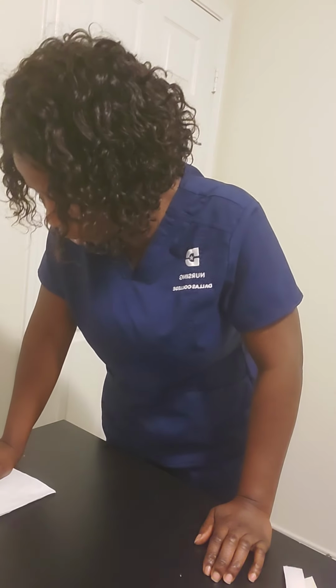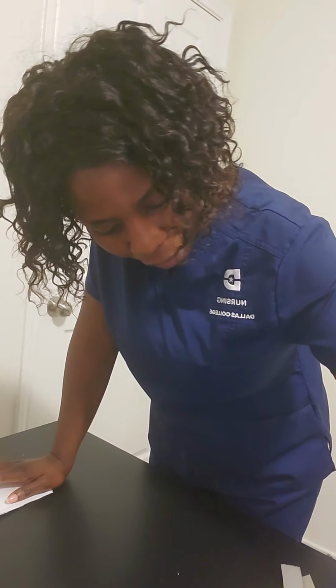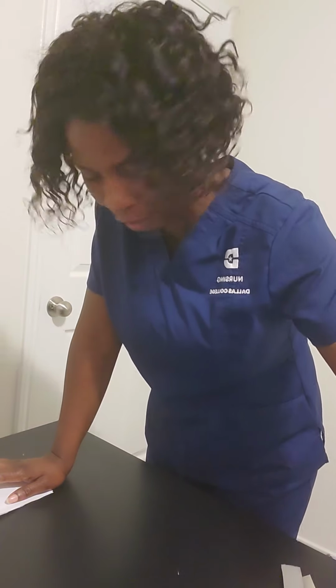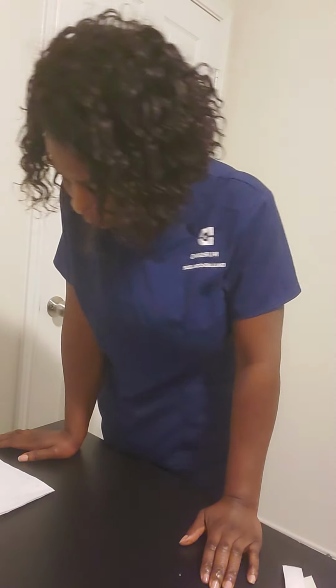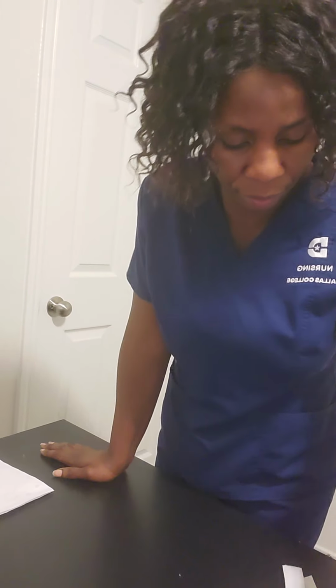I'm going to put on a new glove. Using the information, I have number 1 medication, ceftriaxone 1 gram, IM Q 12 hours for infection. In the drawer, I'll look for ceftriaxone. Here is ceftriaxone injection powder, and the dosage I have here is 1 gram. No need of measurement. I'll be able to see what I want. It says reconstituting 2.5 ml sterile water, and I have sterile water here in the drawer. I pull it out.